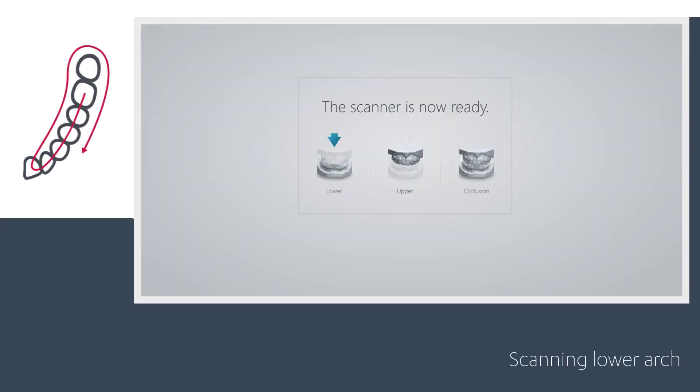Place a clean scan tip on the scanner with the mirror facing down for lower arch scanning. Use your finger or a dental mirror to create space between the teeth, lips, and cheeks if required.